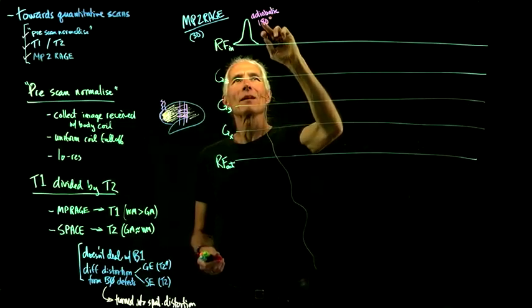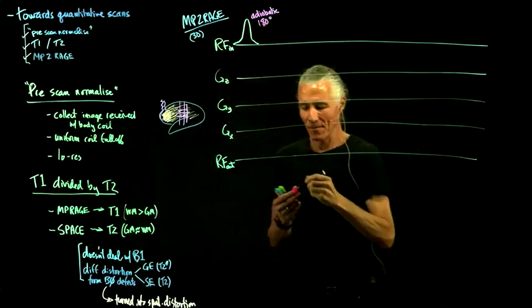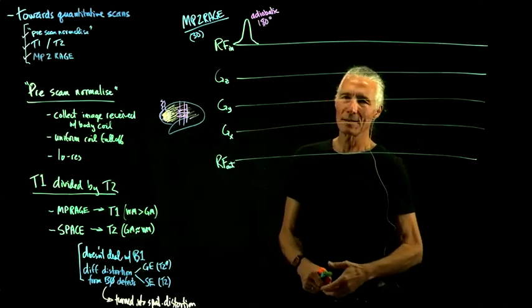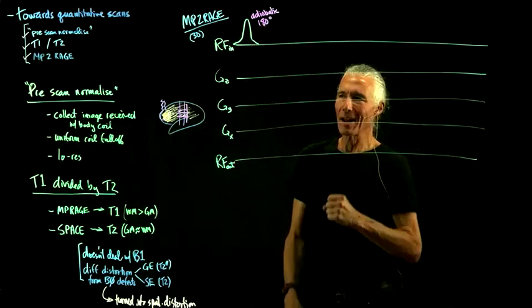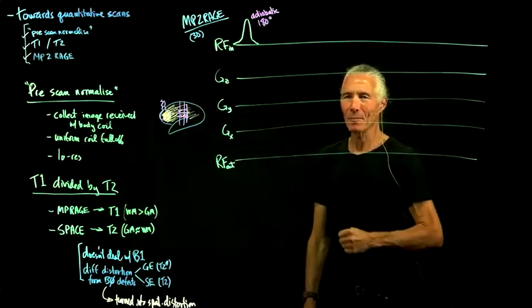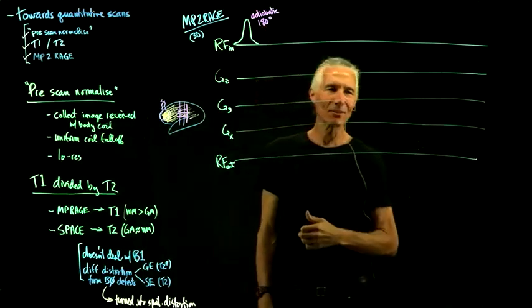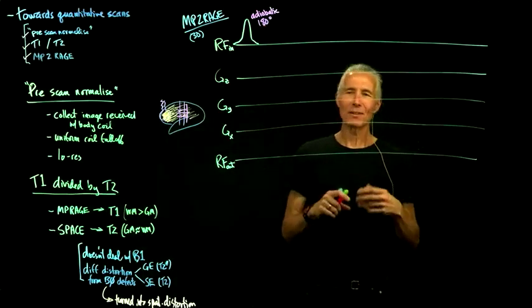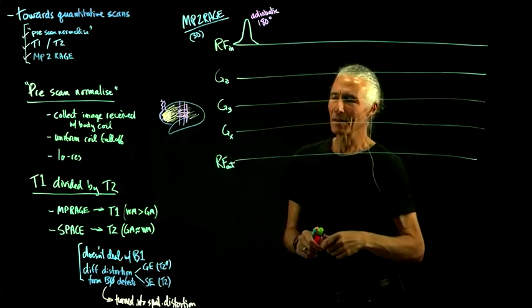So why don't we do that all the time? If you do a hard pulse, or even a sinc pulse, that's kind of more like a hammer. You're just banging on the brain. An adiabatic pulse means a kinder, gentler pulse, where you take your time and slowly sweep all the protons into alignment with each other.